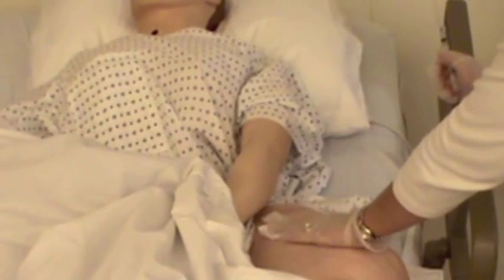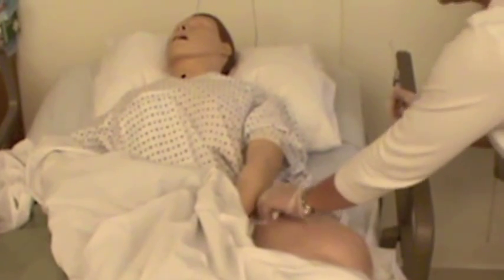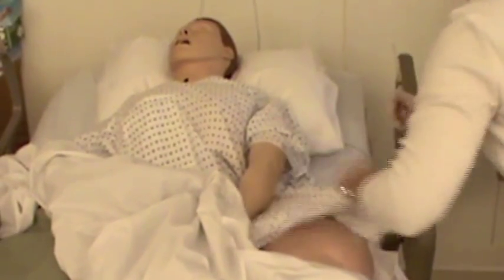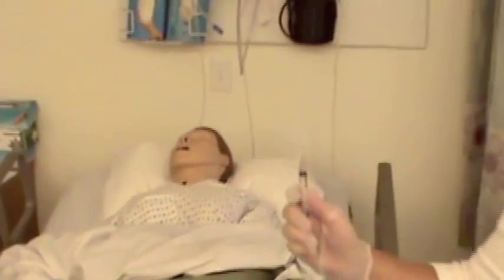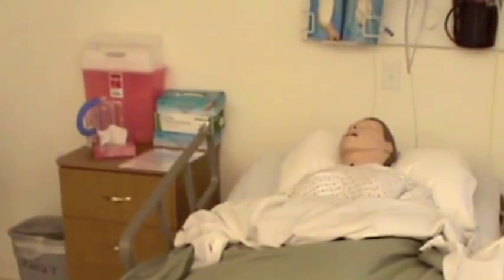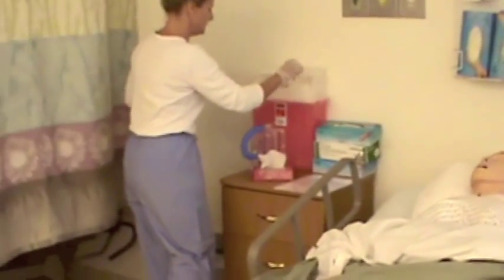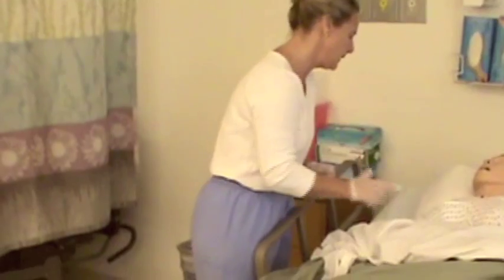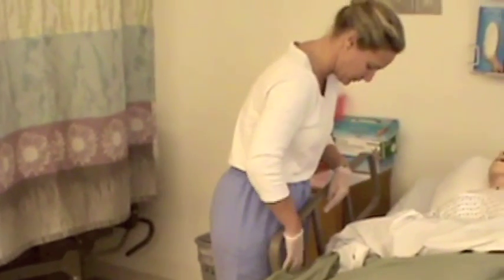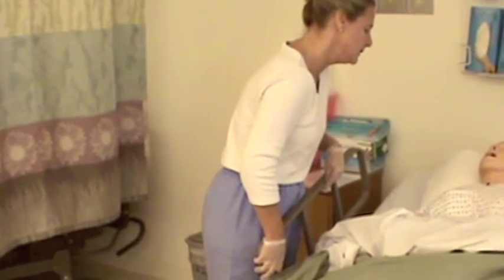You did great, Mr. Ito. Okay. All right, I'm just going to cover your hip up again here. I want to get rid of this right away and put it in the needle box. In the sharps container. Okay, you did really well, Mr. Ito. Can I help you with anything else? How about, should I reposition you? Would you like your head up a little? Oh, it sounds good. Okay.